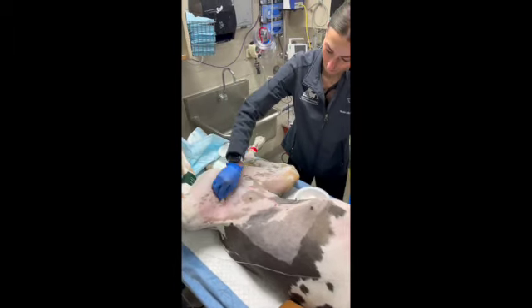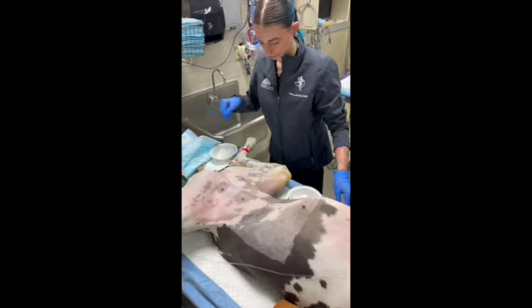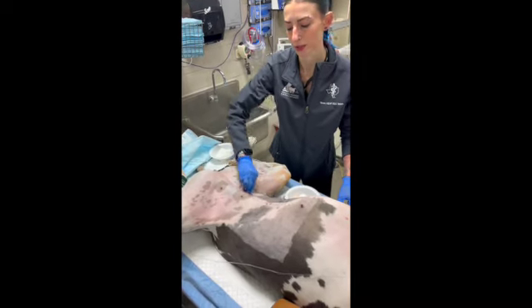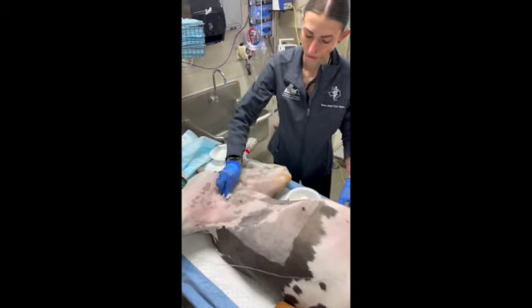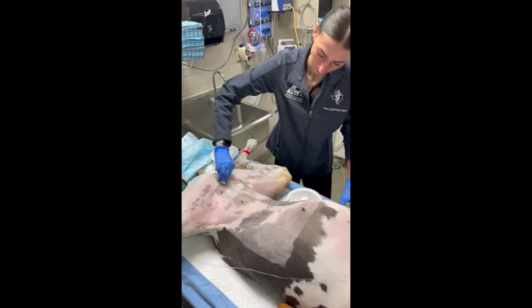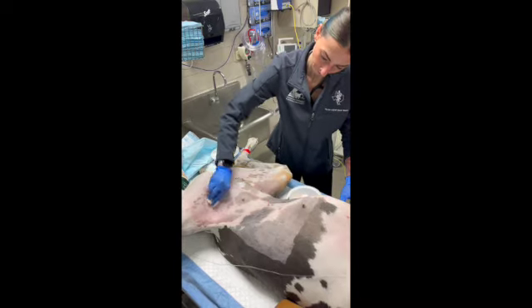Blood pressure is a bit low, heart rate is high, right? So that's why I'm trying to be more careful. We're going to do this 3 times, switching back and forth between the chlorhexidine and the alcohol. Potential cause, like hypotension, maybe hypovolemia at this moment.